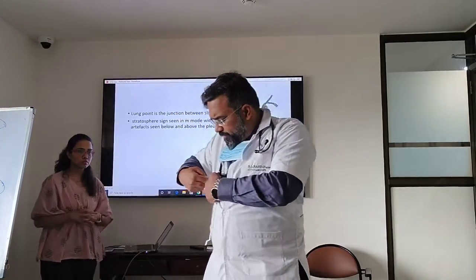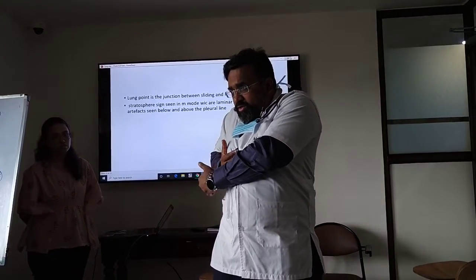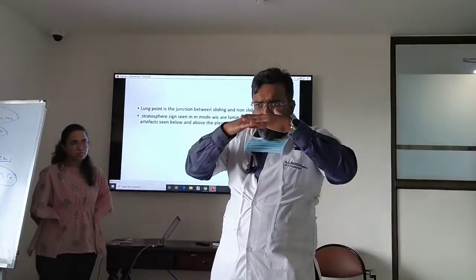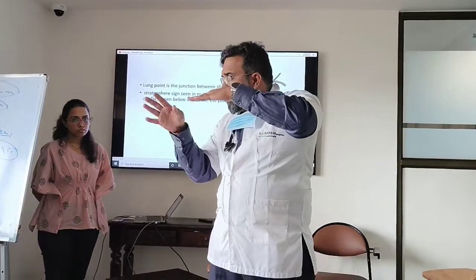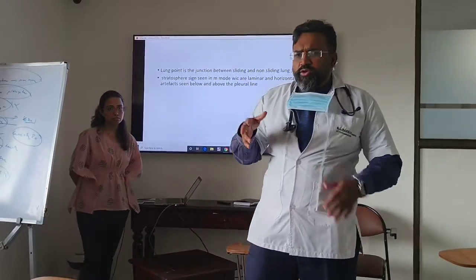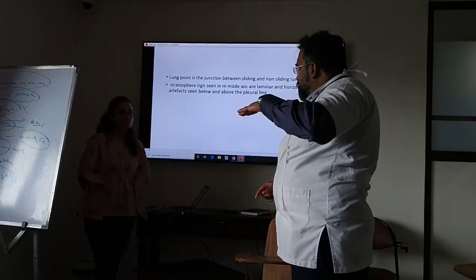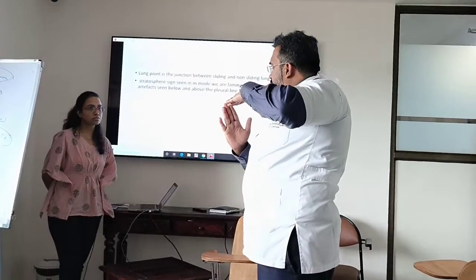If you have a lung that's collapsed, it is this point where there is lung and there is no lung. So you are placing a probe right here. If you are placing a probe right here, you are getting lung and no lung. So you will get sliding on this side, and on this side there is no sliding, there is nothing at all, black color. That's how you can say it, but the M mode will cut it right here, so you may not see this and this, unless you cut the M mode in such a way that you're cutting it right over here.